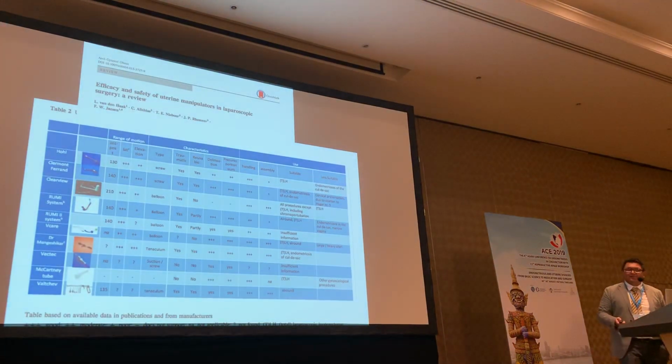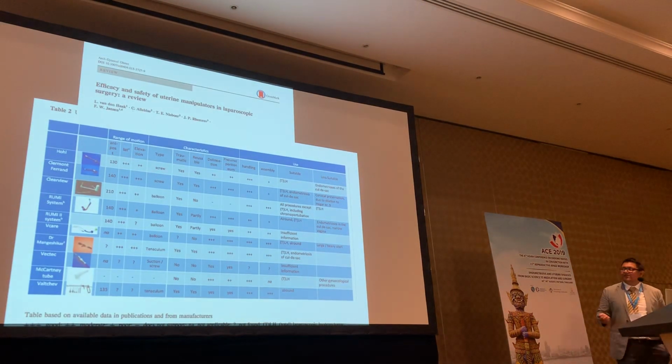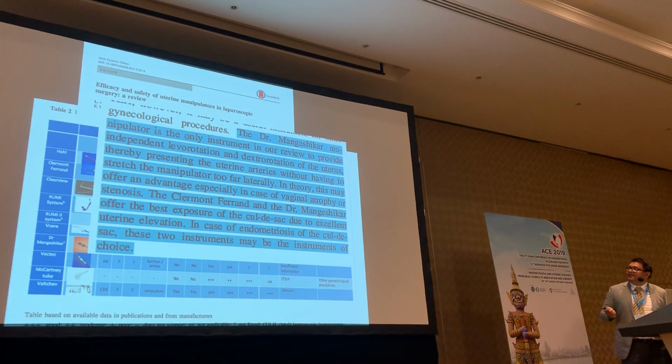So speaking of uterine manipulators, the literature is hard to find. This was one of the papers by Janssen et al. in the Netherlands. This was a comprehensive review of most manipulators available on the market, and they found the Mangeshikar manipulator and the Clermont-Ferrand to be the top of the list. The Mangeshikar scored over the other one because it allows you to levo and dextro rotate the uterus. And they said in case of endometriosis with the cul-de-sac, they may be the instruments of choice.